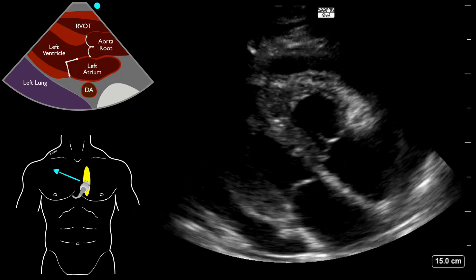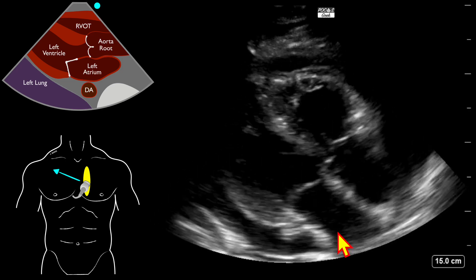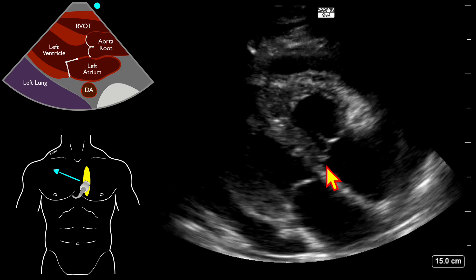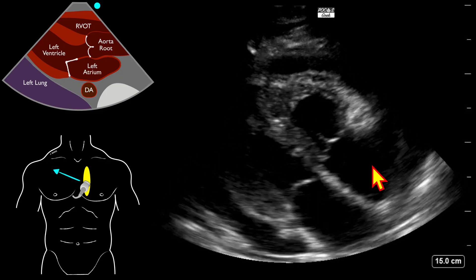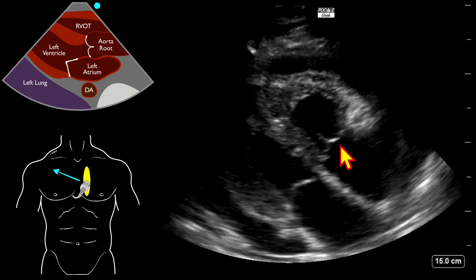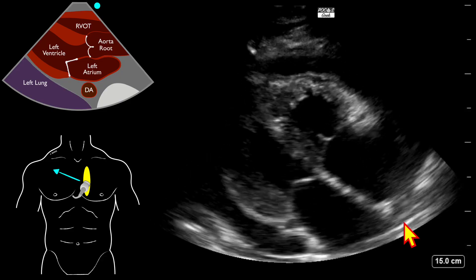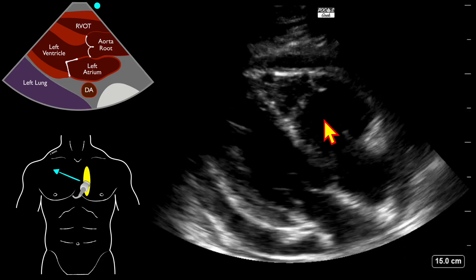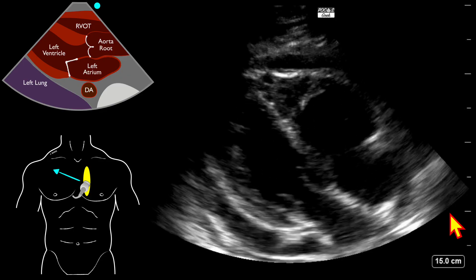This is supposed to be a parasternal long axis. It is off-plane, and sometimes when we have pathology, it alters things just a little bit. We know this because we don't see the aortic root or the left ventricular outflow tract, and we are seeing what looks like the right atria and the tricuspid valve. This could be corrected by fanning superior, which would bring in more of the left ventricle and get rid of the right ventricle side of the view.